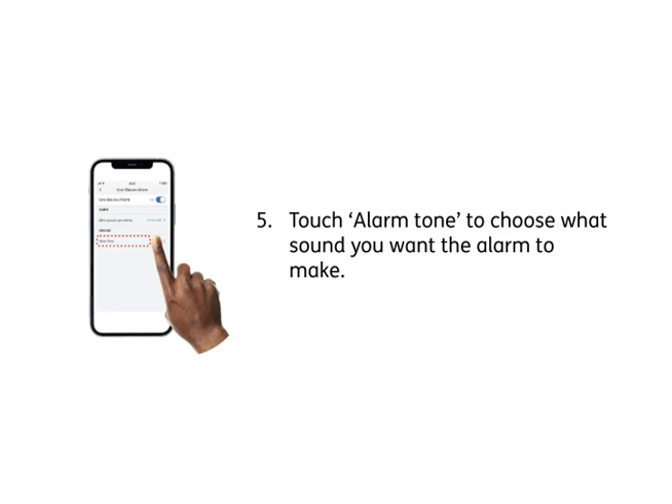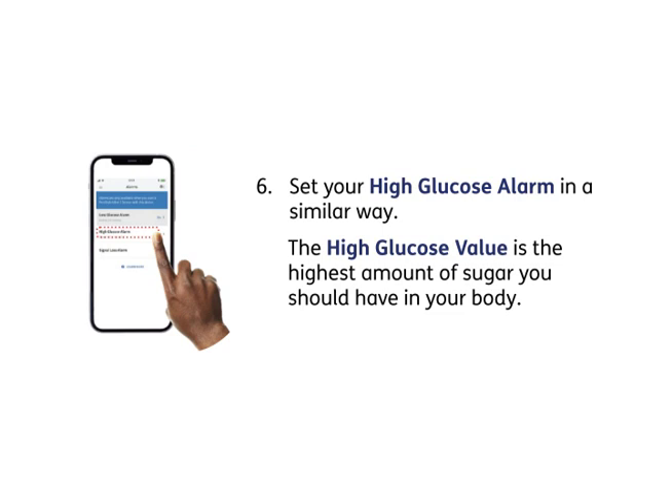5. Touch Alarm Tone to choose what sound you want the alarm to make. 6. Set your high glucose alarm in a similar way. The high glucose value is the highest amount of sugar you should have in your body.